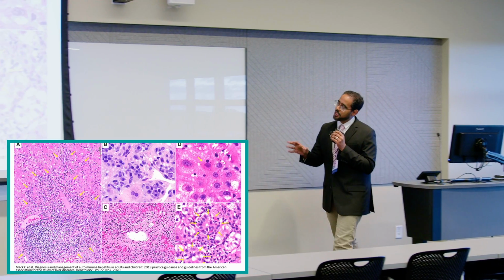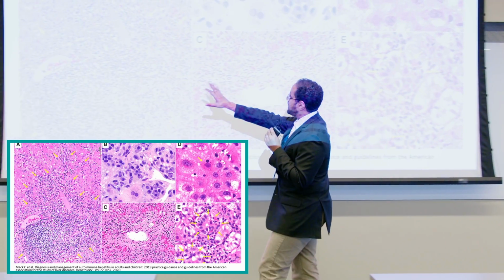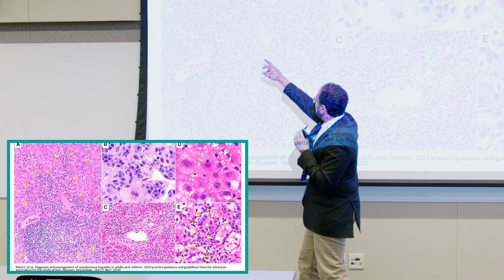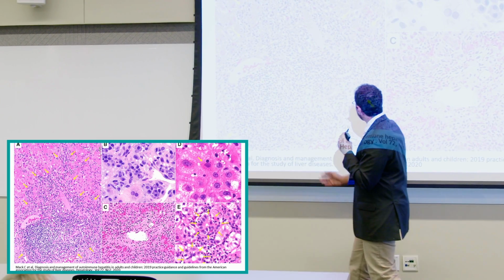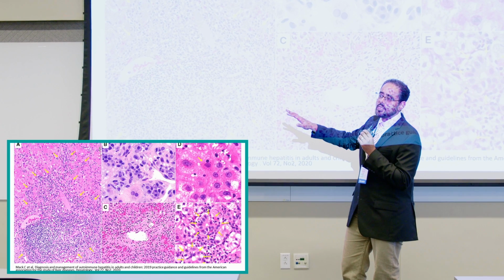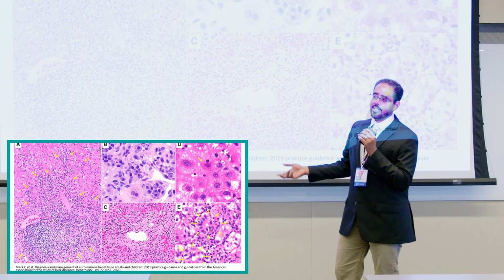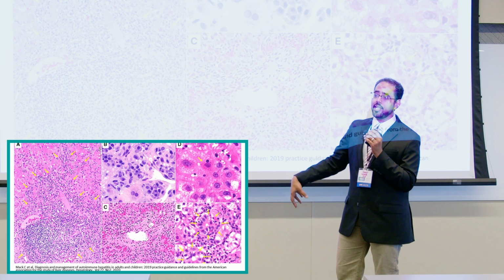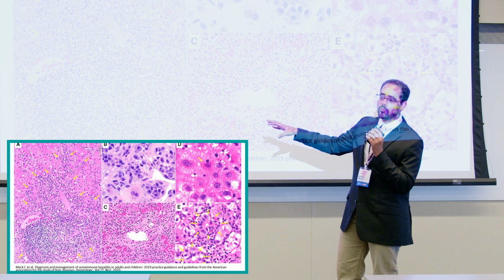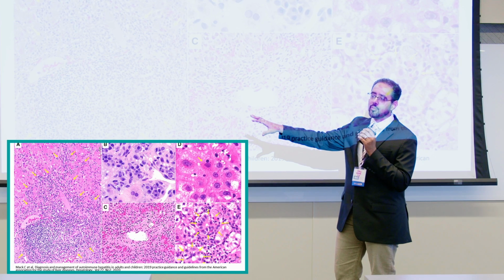So these are multiple pictures that show the classic features of autoimmune hepatitis. This area was the empty area we looked at that has the duct and the vein, and I can't even see the artery anymore. It's very busy. It has a lot of cells. These are the immune cells that were recruited from the body because they presume the liver cells are the enemy. So now they're coming to attack the enemy, which is the liver cells. They accumulate in the portal tract. So that's what I see under the microscope: a ton of inflammatory cells in the portal tract.